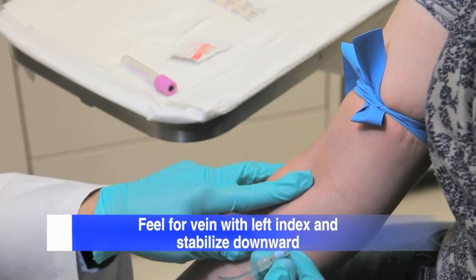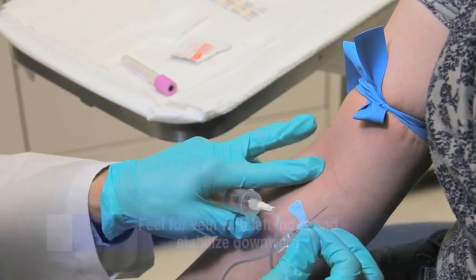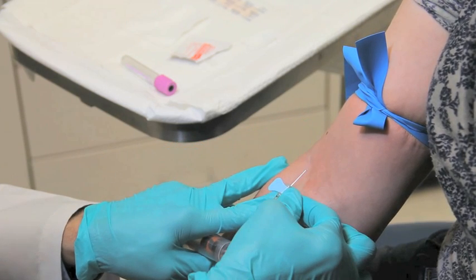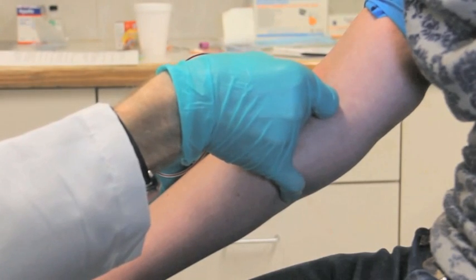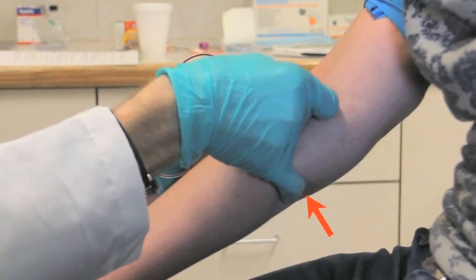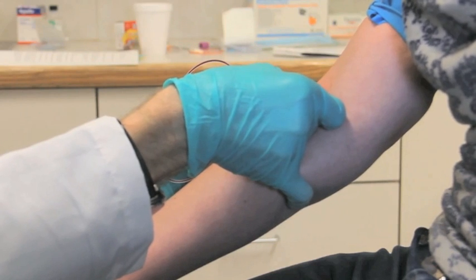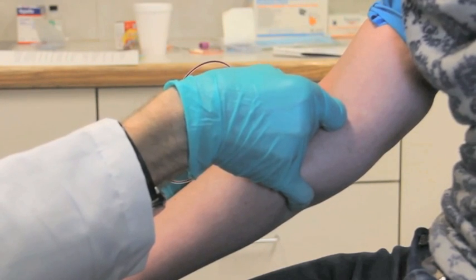Once again, use your left index finger to find the vein for the final time and apply gentle pressure to drag it distally with the left index finger. The third distal interphalangeal should be firmly touching the arm of the patient while the pinky is under the patient's arm, providing stability. This allows your hand to move with the patient if he or she suddenly moves their arm.